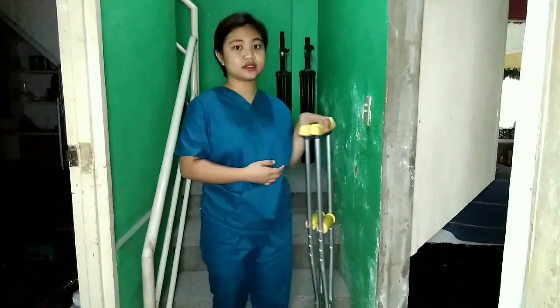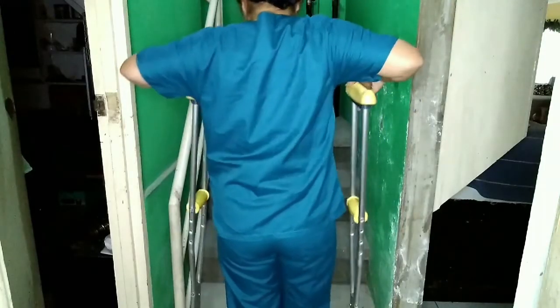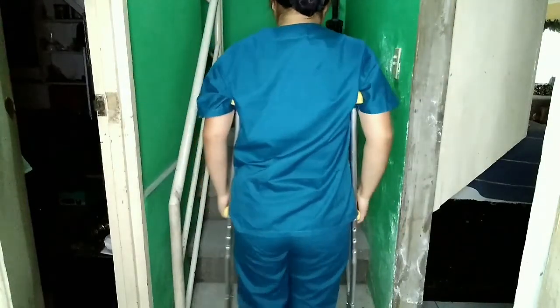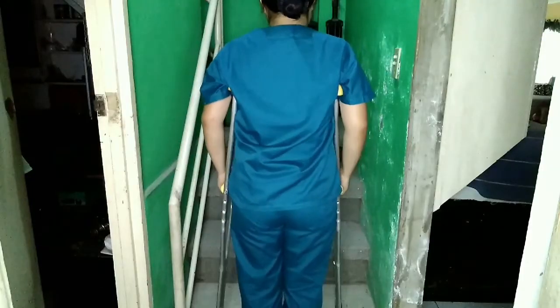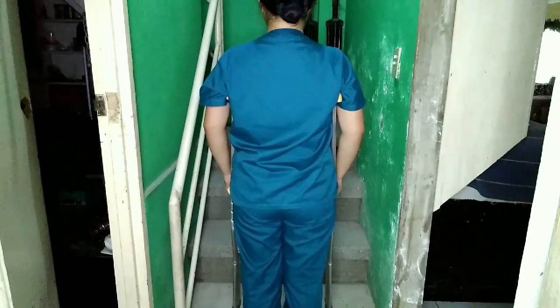Help the patient to climb using these crutches. Begin in tripod position. Transfer the patient's body weight to the crutches and position the patient with the handrail on the side of the strong leg. Support weight evenly between crutch and handrail. Place some weight on the crutches and step up with the strong leg. Allow the patient to regain balance.